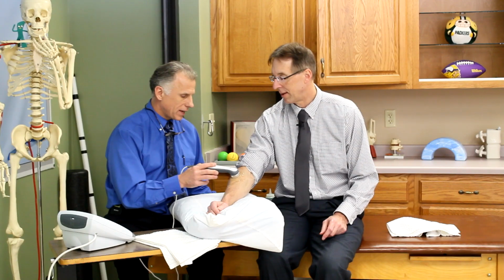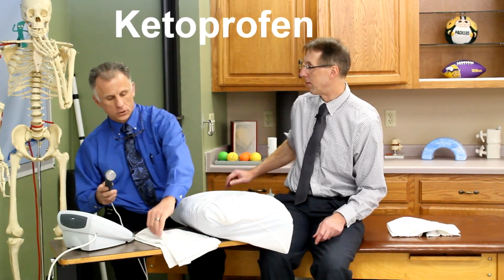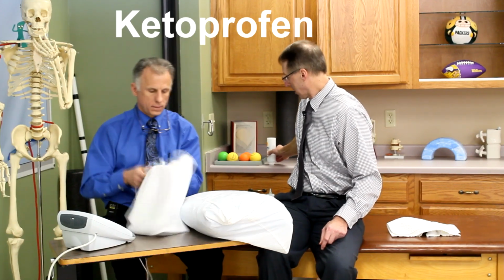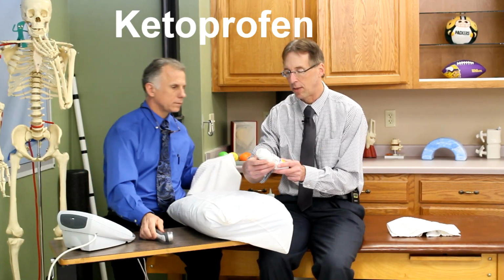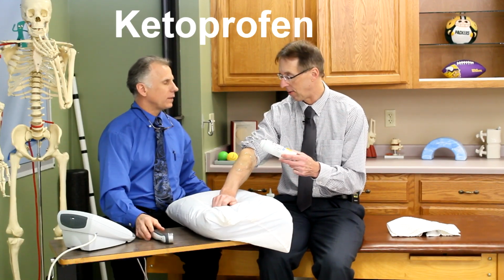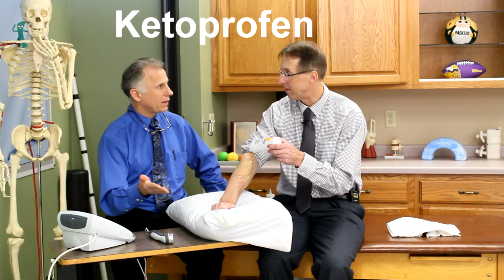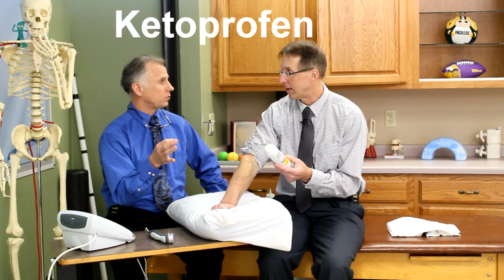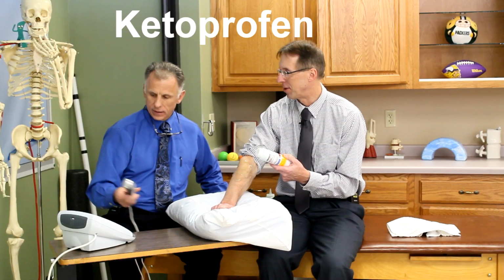Maintain contact. Exactly. Now, Brad, I often use this with ketoprofen, which is a type of medicine that's kind of a strong anti-inflammatory. And this actually has ketoprofen mixed in with the gel already. In that case, I might go right over the tender spot. But then we usually go pulsed, at 50%. And I imagine they probably don't even have pulse on those home units.